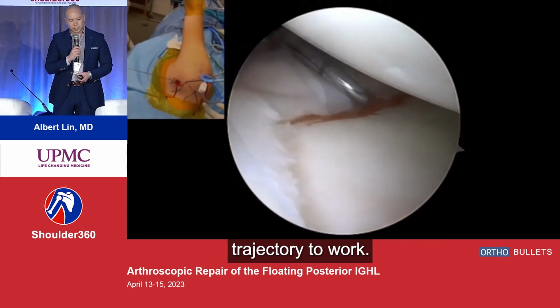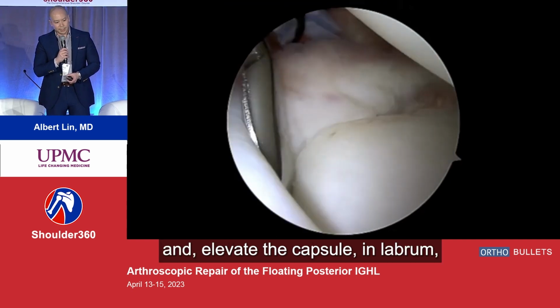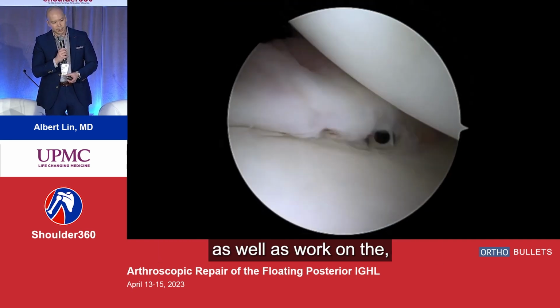So this is us making our anterior portal. We want to make sure that we have appropriate trajectory to work and elevate the capsule and labrum as well as work on the cortical surface.